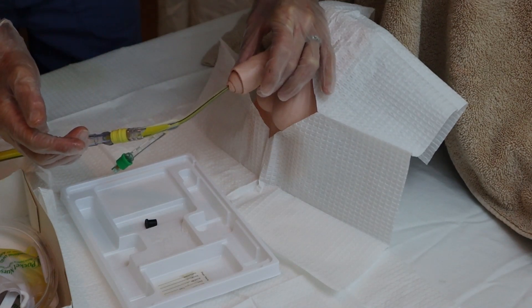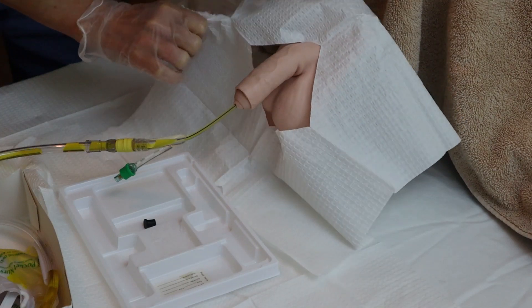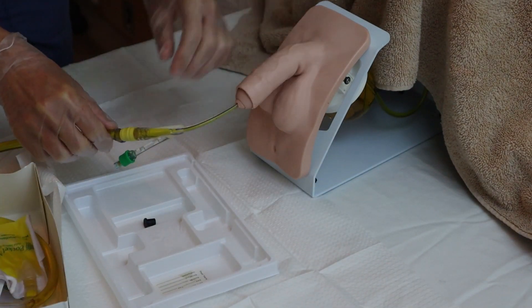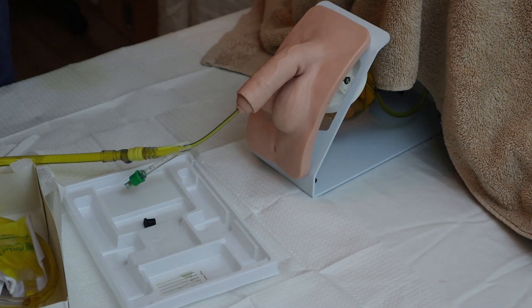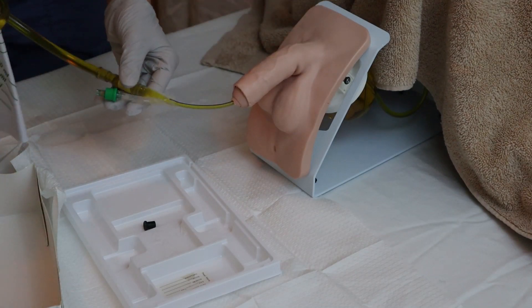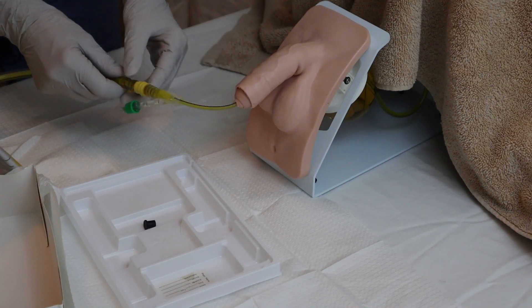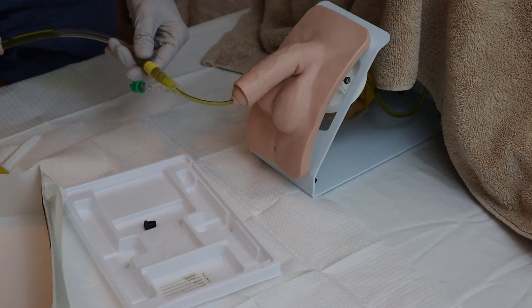In this uncircumcised patient, I want to make sure I pull the foreskin back over the glans penis, otherwise I might cause complications down the road. My sterile procedure is now done. I gather my equipment — the easiest way is to tear the fenestrated drape and remove it. Since I might have lubricant on my sterile gloves and no longer need to be sterile, I remove my sterile gloves, perform hand hygiene, and don clean gloves. Then I take the catheter and use the leg securement device to secure it to the patient's thigh, following your facility's policy on attachment.